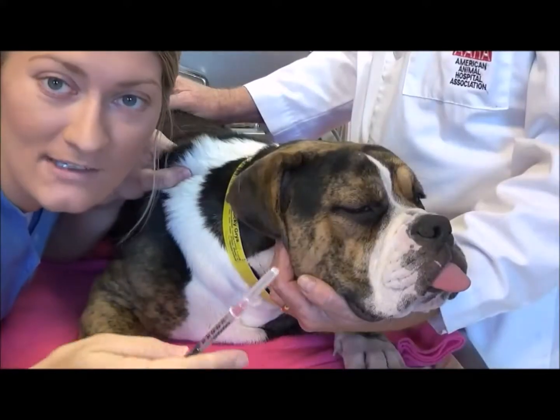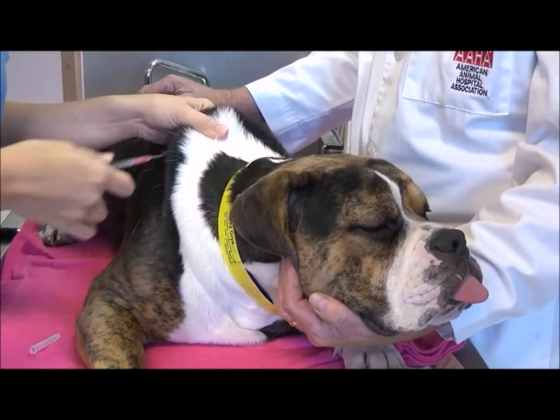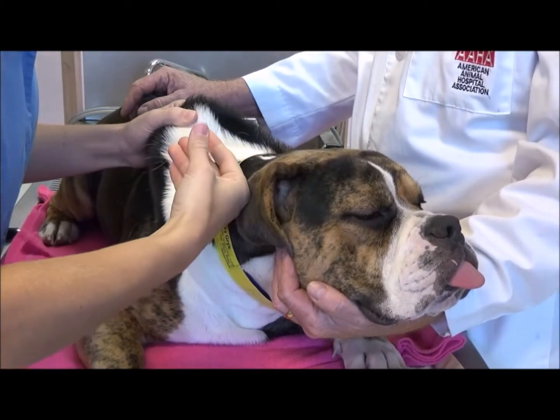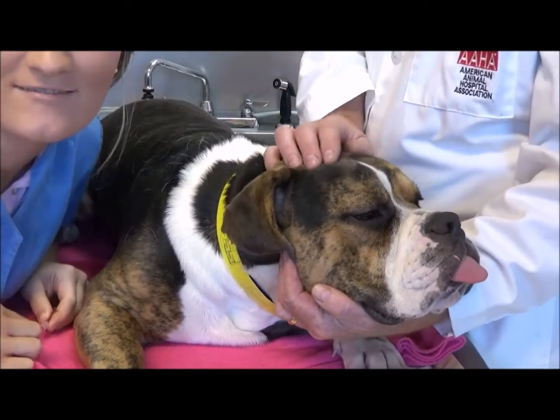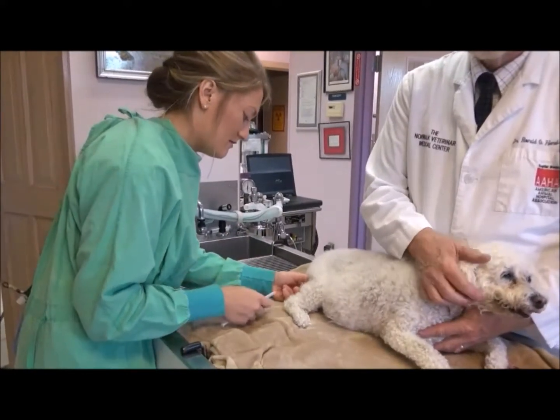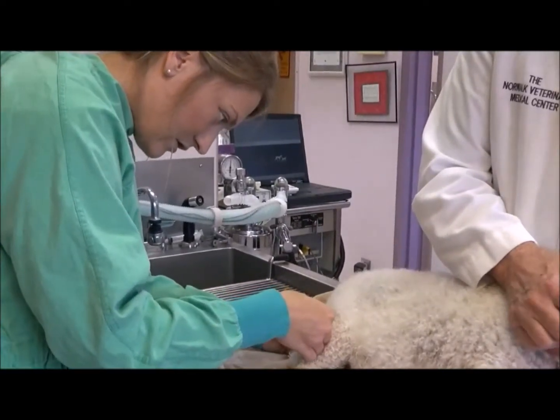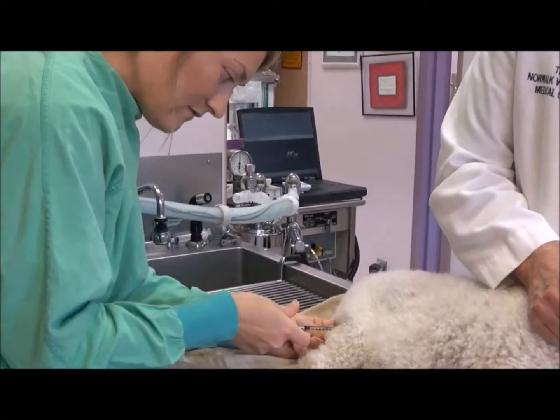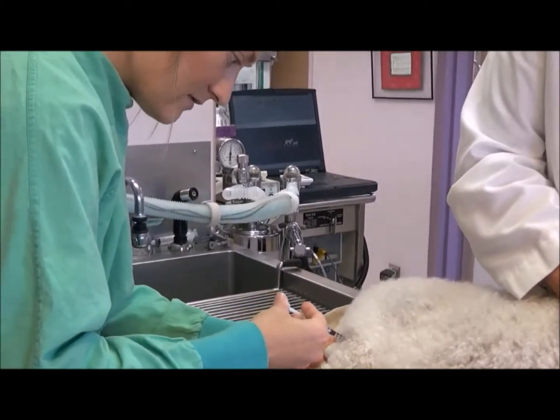All done. I'm going to give a sub-Q injection of saline. All done. Now I'm going to perform an IM injection using saline. So once I'm in the muscle, I'm going to aspirate the syringe just to be sure I'm not in a vein. It looks good. So now I'll go ahead and inject the solution.